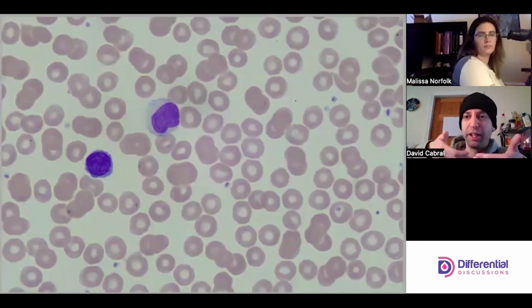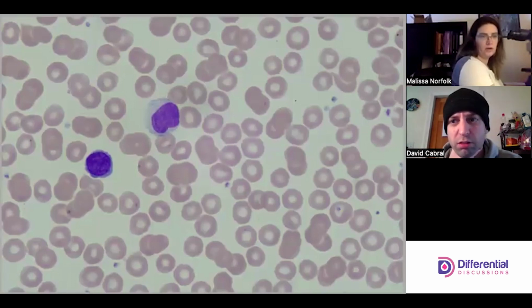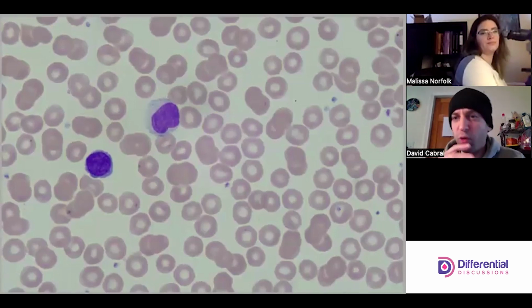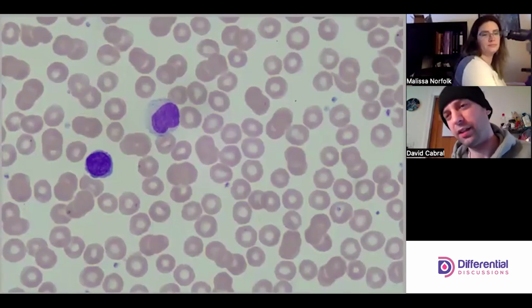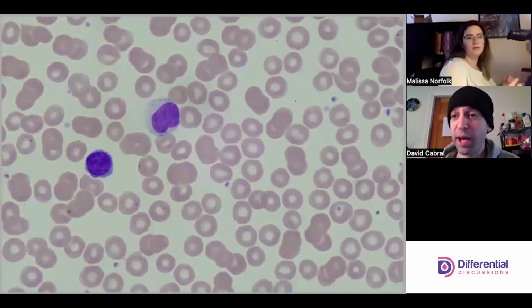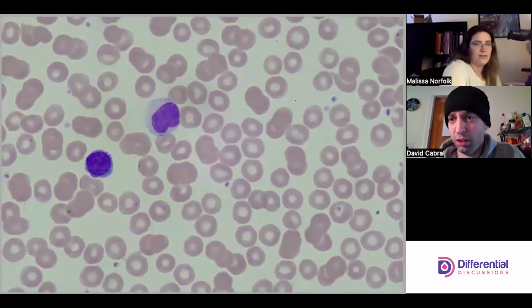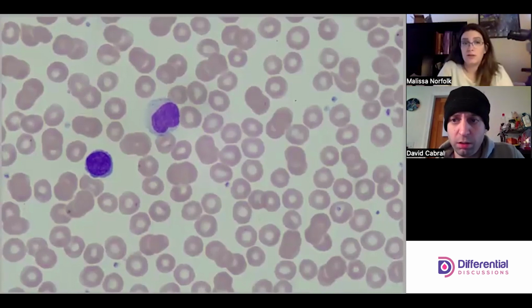This lymph does have a little bit of a cleft to it, but not crazy so. Yeah, it's not a really odd contour. Right, just a slight cleft. Yeah. And the kidney bean or circular shaped nucleus, I think that looks fairly normal. And the chromatin patterns on all these cells have looked beautiful for the most part. Did you have something to add? The cleft isn't like a huge cleft, and there's not a lot of lymphs that are clefting, which would differentiate it from more of like a malignant process.